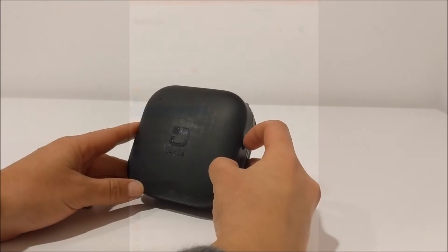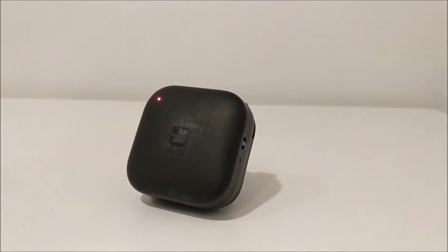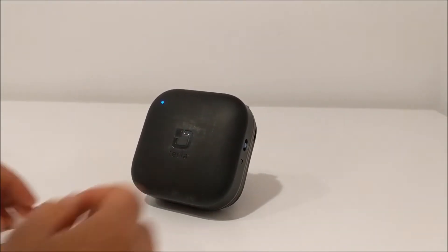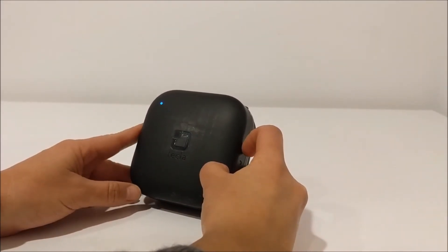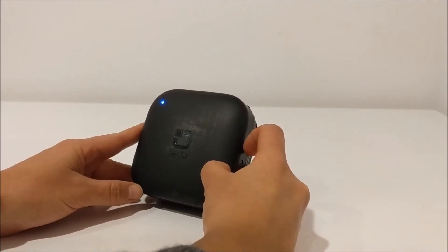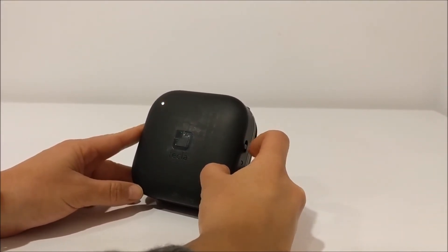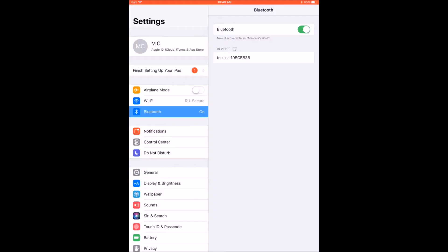Then turn on your Tecla-E by sliding the three-way power switch to the middle position. To put your Tecla-E in pairing mode, slide and hold the blue power switch to the bottom-most position for three seconds, at which point the Tecla-E will make a pairing sound.